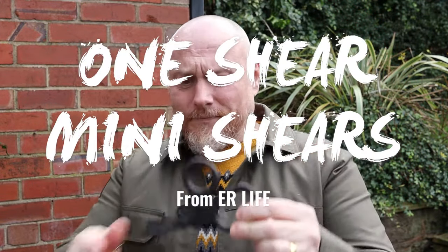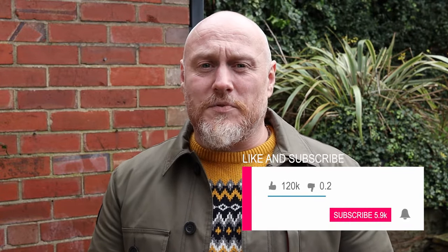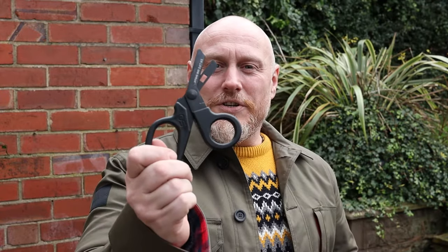Another contender has entered the fight: the One Shear Trauma Scissors Mini. These are awesome. I've been able to test these out over the last just over a month now, and as far as EDC is concerned, these are great. You're probably thinking: why would you go for the mini rather than the larger pro version? Hopefully we'll have a look at that today.